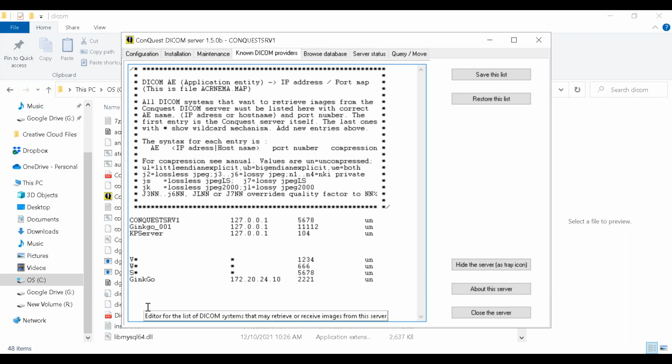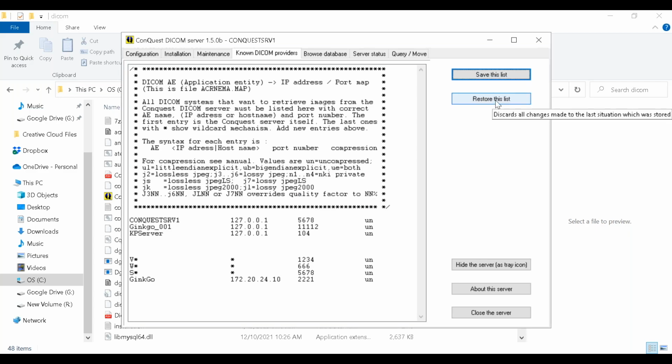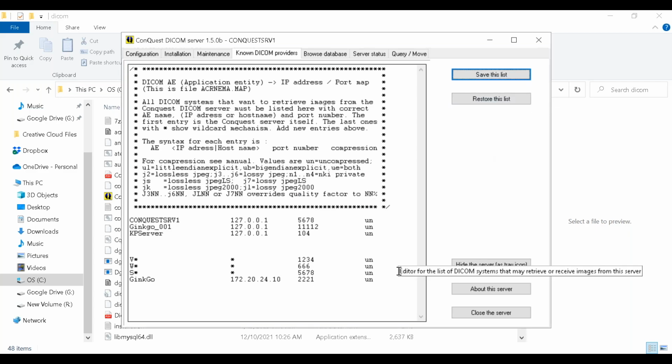Now keep in mind, even though we are reading this, there are invisible characters in here. There were some tab characters in there, right? And then there was this return at the end that knocked us down to the next line. I'm just going to go ahead and save this list. Yes, we're going to save that. And it should work. Actually, folks, as weird as it sounds, that is the information that I'm going to use for my client. I know a lot of you are like, where did these numbers even come from?